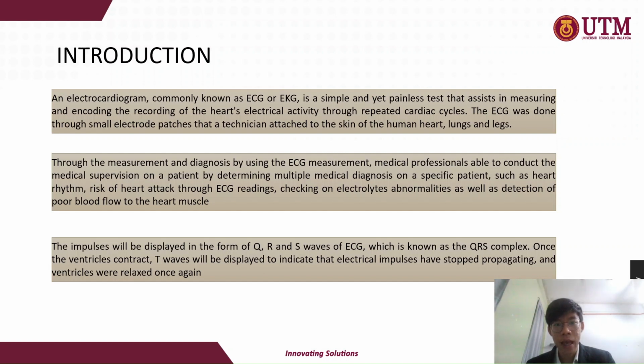Through the measurement and diagnosis using ECG, medical professionals are able to conduct a thorough medical review, especially towards heart-related diseases such as heart rhythm, risk of heart attack, and at the same time check on electrolyte abnormalities and detect poor blood flow to the heart muscle.